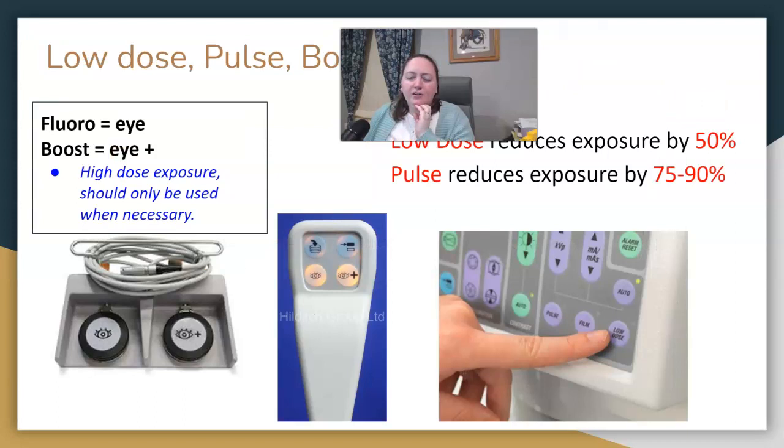There are a few settings more specific to fluoro and C-arms for reducing dose. On your foot pedal, I want you to know these icons. The eye icon is x-ray exposure — if you stand on it and stay on it, it's going to fluoro. The eye with a plus is called boost, which is a high-dose exposure and should only be used when necessary. You'll notice an additional audible tone when using boost. Both of these icons are also on your hand remote if you have one.